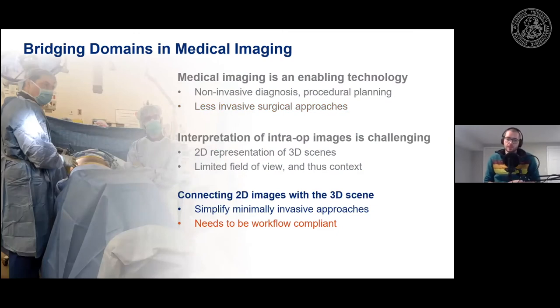So consequently, there is a lot of work going on that tries to connect the 2D images with the three-dimensional scene in order to simplify these minimally invasive approaches and provide navigation and guidance to operators in these scenes.